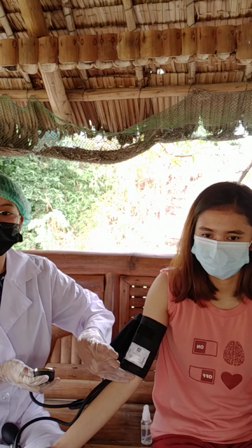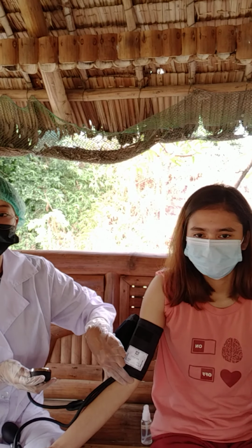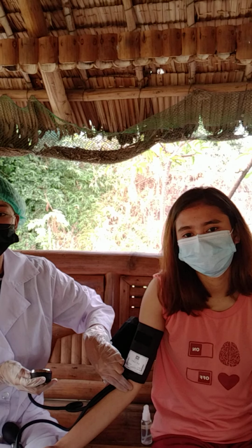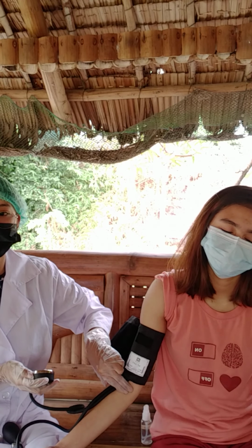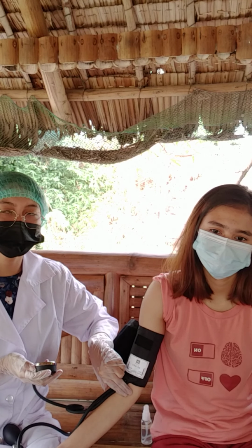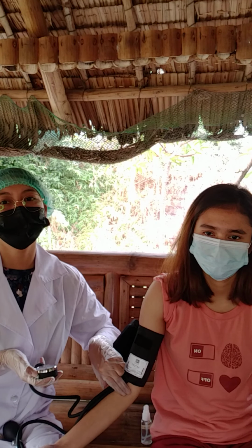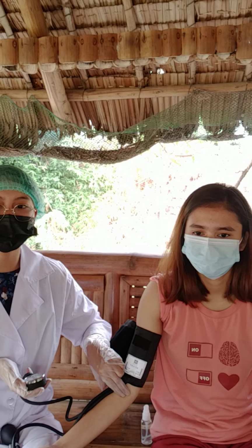And then, after that, tighten the screw valve on the air pump. And then, inflate the cuff while continuing to palpate the artery and note the point of gauge where the pulse disappears. And then, deflate the cuff at 1 minute. And then, after that is obtaining blood pressure measurement.